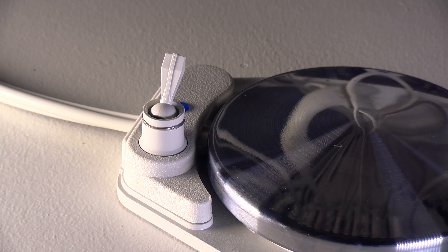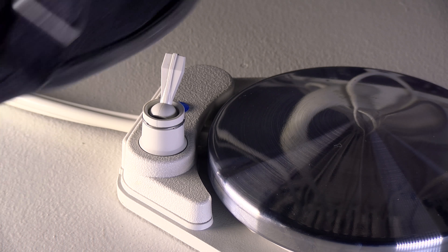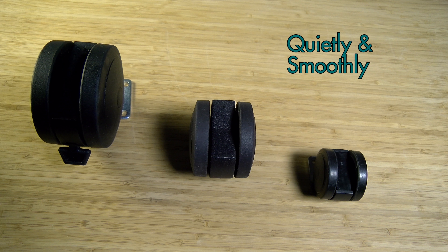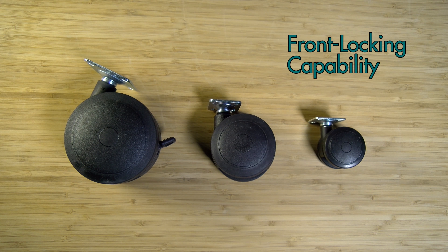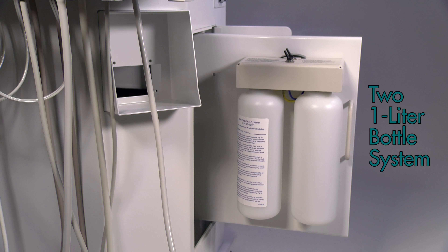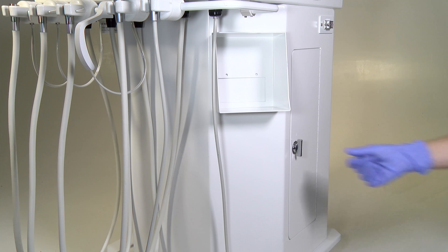The water on/off toggle features a metal tower for dependable heavy use. The cart is easily maneuvered using high-grade caster wheels that roll quietly and smoothly on multiple floor surfaces with front locking capability.